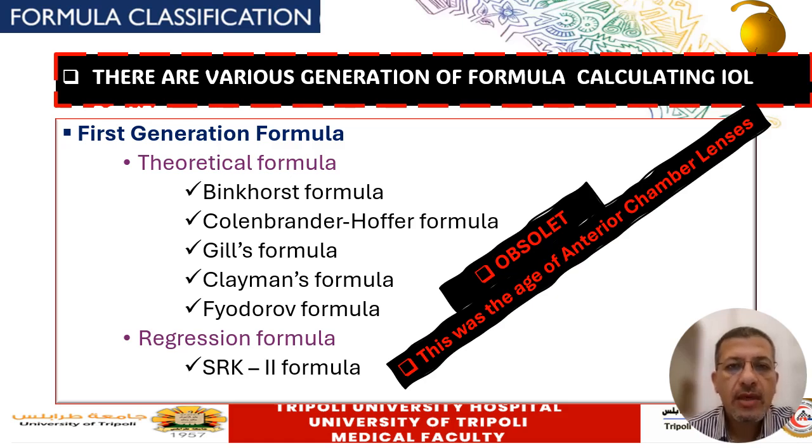Actually, neither of these two ways of classification is superior to the other, because to properly understand and enjoy these formulae, you need to understand the historical background as well as the basic optics behind them, how they work, so that you can differentiate between the different formulae, as well as choose the best way that suits your practice and fits with your facility, from equipment and the type of IOLs that you are implanting.